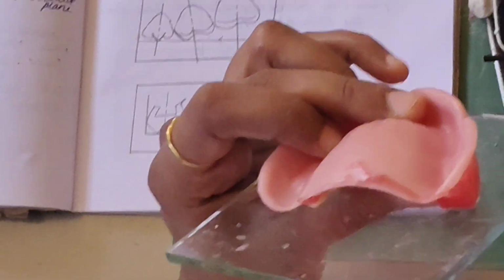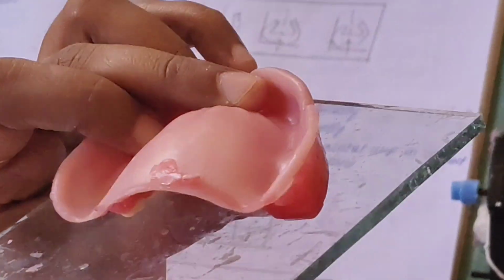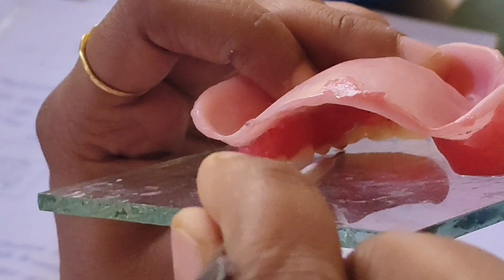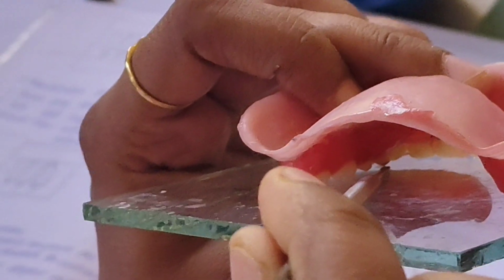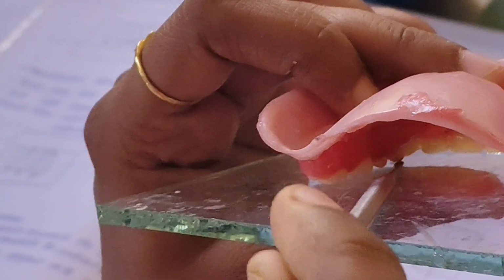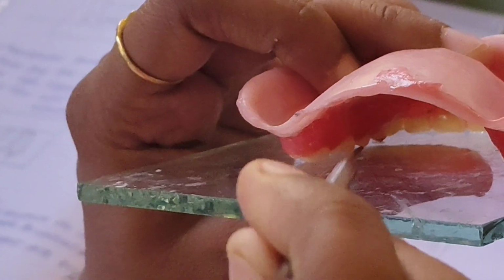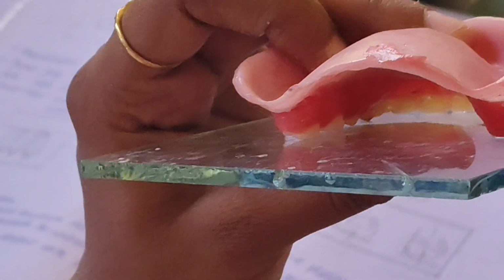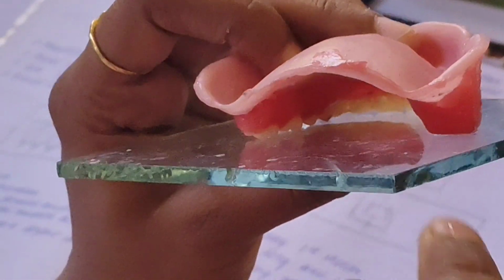Like you see from here behind, this cusp is not touching. I can put the instrument's small part over here. This part is not touching. Here this cusp is touching, the second premolar palatal cusp. This much is understood?